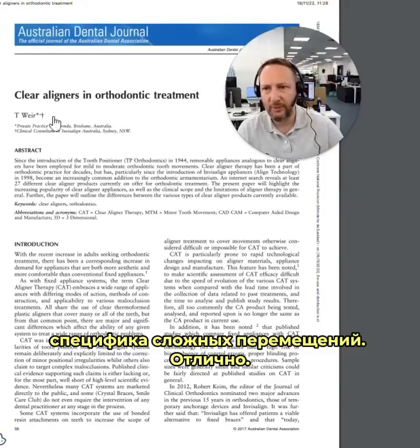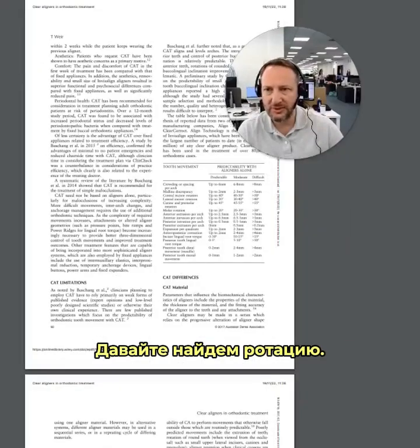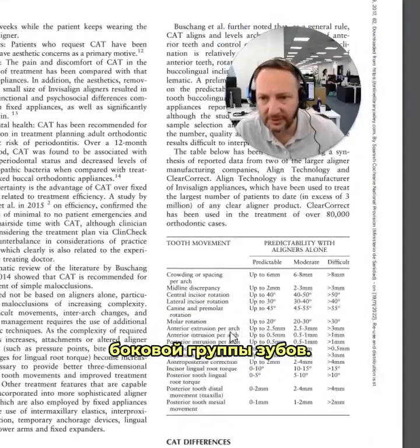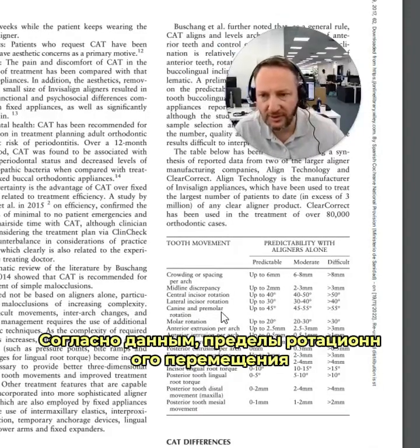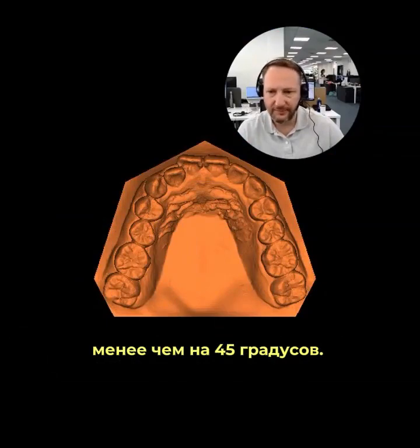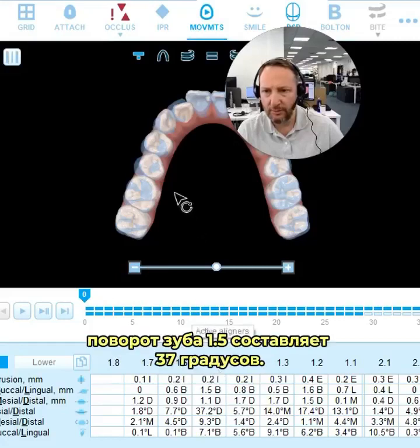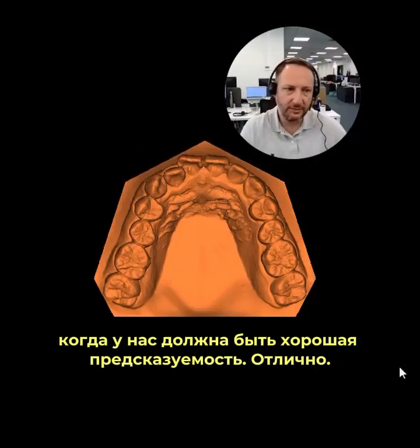When we look at rotations, for posterior rotation, we have molar, canine and premolar, and in this case a premolar, up to 45 degrees is predictable. In the ClinCheck, this premolar, the 1.5, has 37 degrees of rotation, so this is a case that should have good predictability.